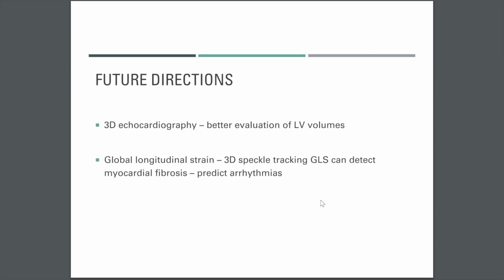And briefly, some of the future directions to improve on the current modality is, again, using 3D echocardiography, as this becomes more common with increasing availability of 3D probes. This gives better evaluation of LV volumes and LV systolic function.